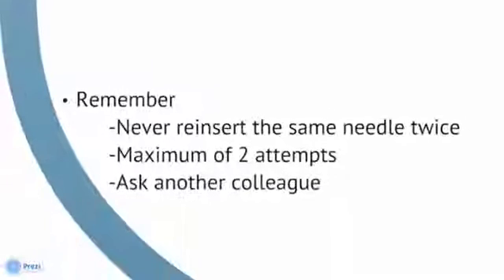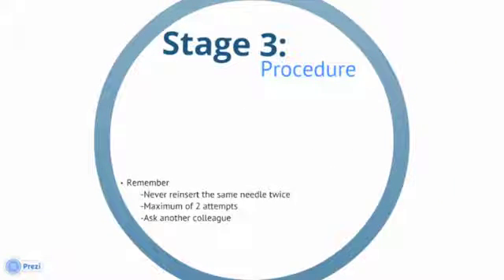Remember, if your attempt at blood culture is unsuccessful, you should restart the whole process from the beginning. Never reinsert the same needle into a patient. You can have a maximum of 2 attempts, and then you must ask another colleague to perform the procedure.